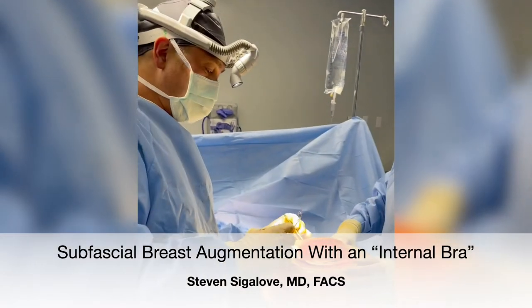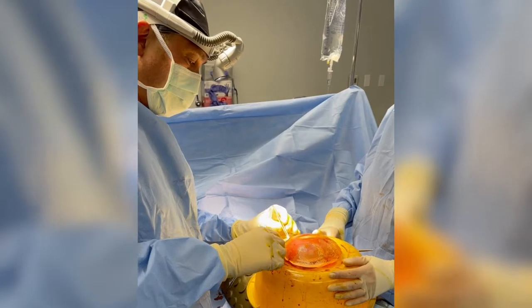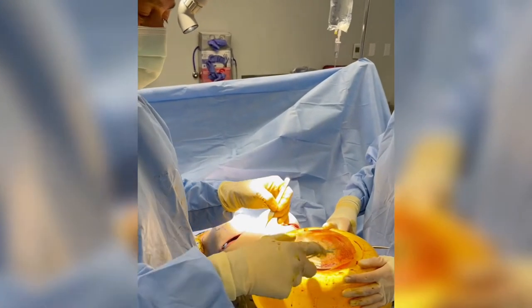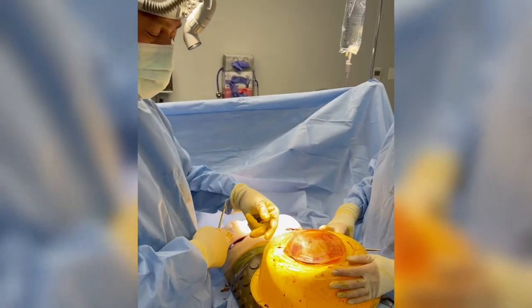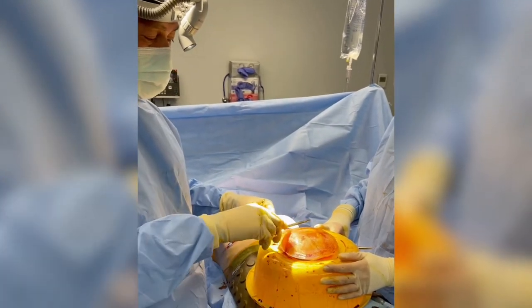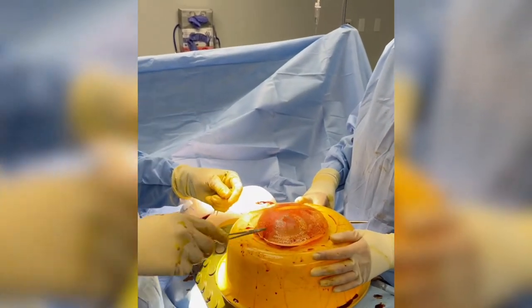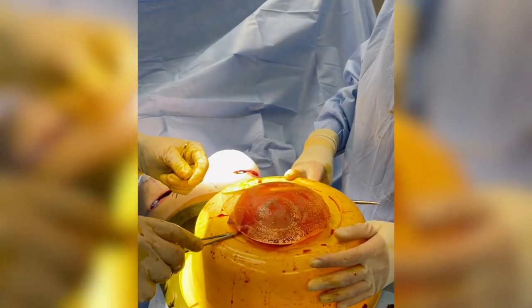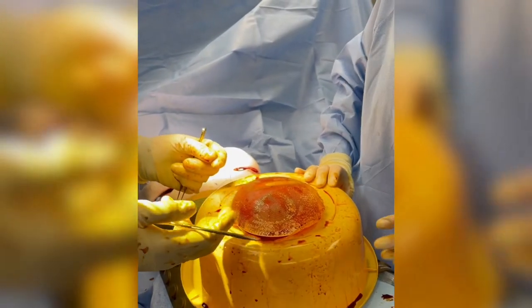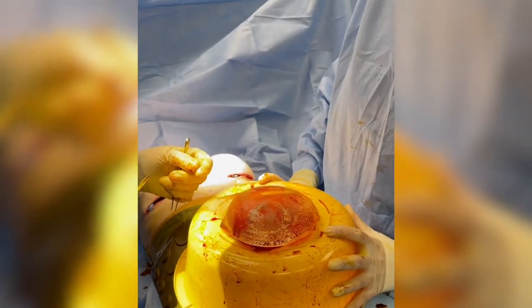Hey, it's Dr. Sigalov. I'm now sewing my Galliflex ravioli around my implant. We're going to use 415cc moderate plus Sientra implants. I'm wrapping it on both sides — Galliflex Lite on the front side and regular Galliflex on the back side. The whole thing is going to go in like a single construct into our sub-fascial pocket.